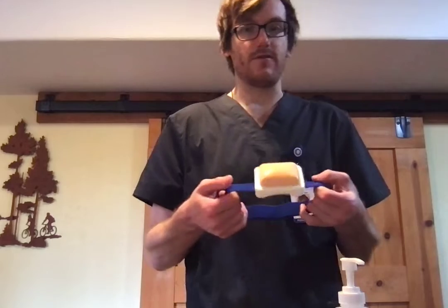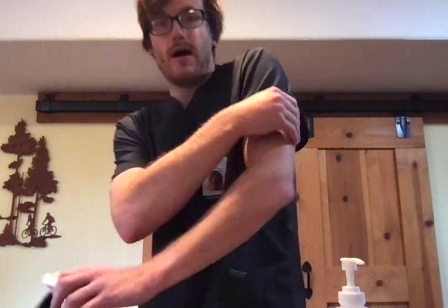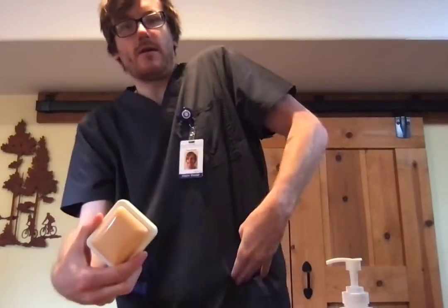My injection site for subcutaneous for this one's going to be in the abdominal area. You can also do it in the fattier part of the back of the arm, like the deltoid. So we're going to do our hand hygiene and get started with this injection. For this case, we're just going to pretend that this little pad is right here in their abdomen.